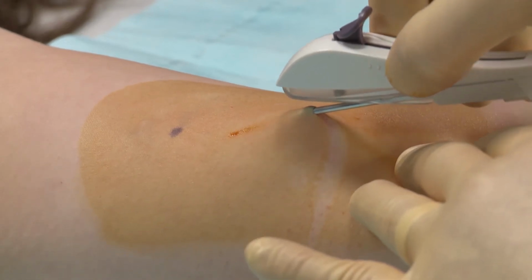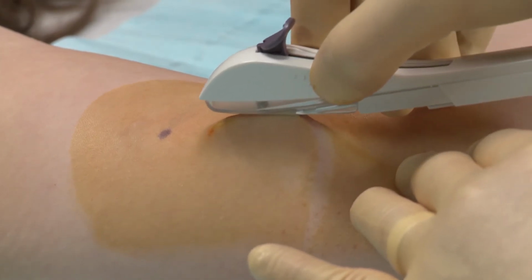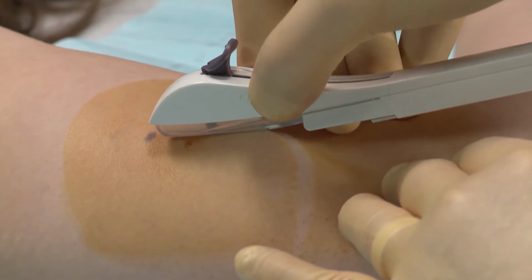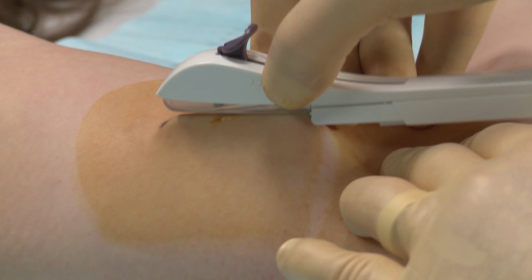Lower the applicator to a horizontal position. While lifting the skin with the tip of the needle, slide the needle to its full length. You may feel slight resistance, but do not use excessive force. If the needle is not inserted to its full length, the implant will not be inserted properly.